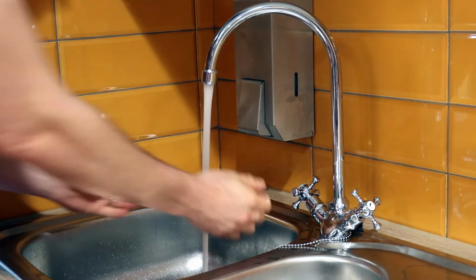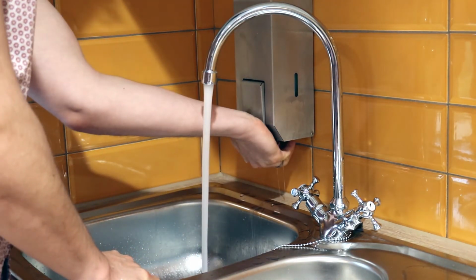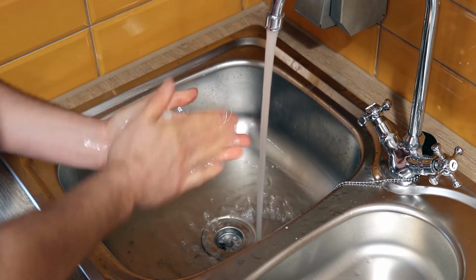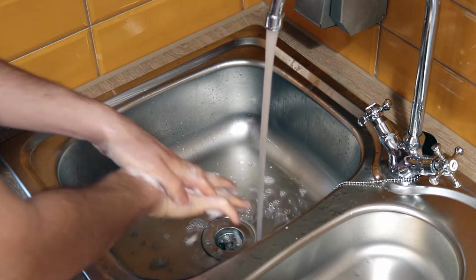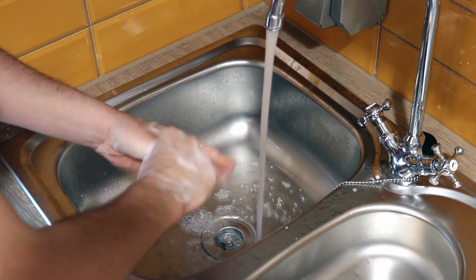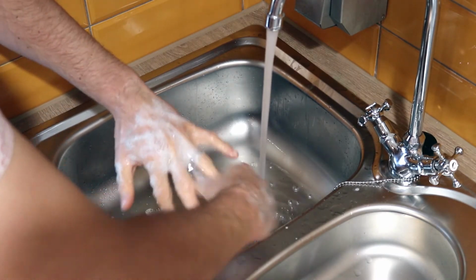Prior to each medication round, ensure you wash your hands thoroughly under warm running water with soap and dry your hands with either a hand dryer or a paper towel. As normal, staff members administering medication should be bare below the elbow, meaning short sleeves, no wristwatches, and a plain wedding band is acceptable. Staff members should never have nail varnish or false nails.